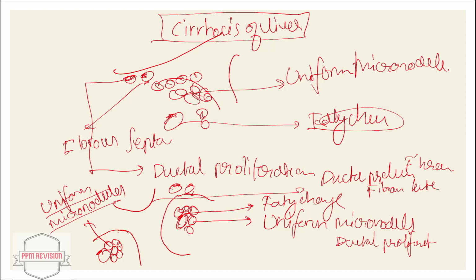Now just looking at some theoretical knowledge, the portal cirrhosis of liver. The normal architecture of the liver is distorted by bands of fibrous tissue. So the normal architecture of the liver is disturbed, whereas in fatty liver we have seen that it is not disturbed. While doing a topic we need to make sure that there are some divisions and we often relate to them so that it's easier to memorize. So here the normal architecture of the liver is distorted.